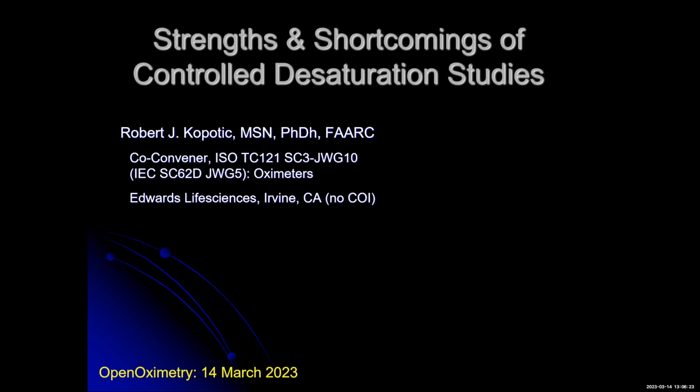So in part, that's incumbent on the manufacturers as well, because they need to make sure their labeling, the official term for regulatory paperwork that's there to emphasize how to use a product, is understandable and not in a place that is only residing with the operating manual, which can never be found at the bedside.